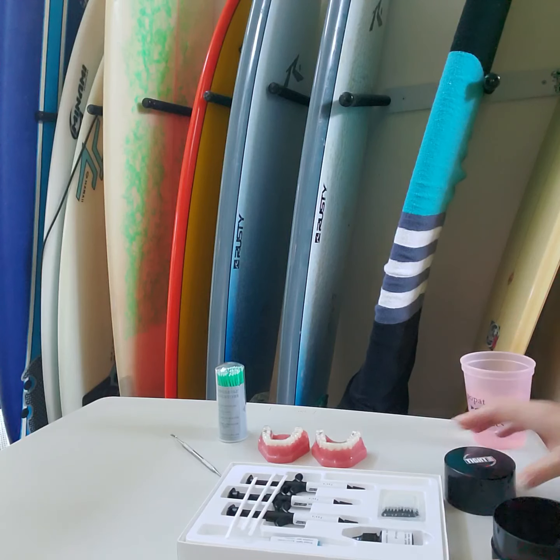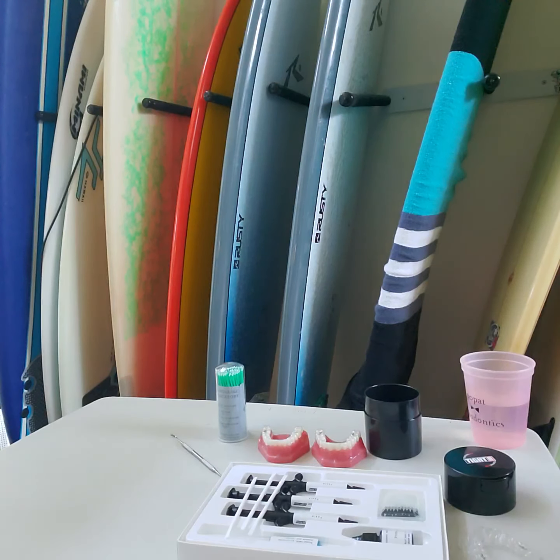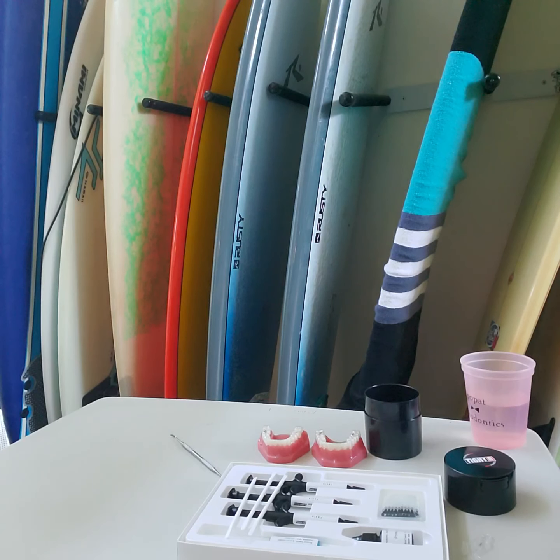So the key is they sell attachment material at Invisalign, but it's very expensive. It's just composite. You don't want a super filled composite, and I wouldn't recommend using flowable either. It gets really messy. I've done it and there's an art to it, but it's not a great way to start. The key is to fill it just enough to pack it in with a micro brush, with a tiny bit of primer on the end, and throw it in there. You need to be able to do this, no joke, in less than 60 seconds, or even less than that.